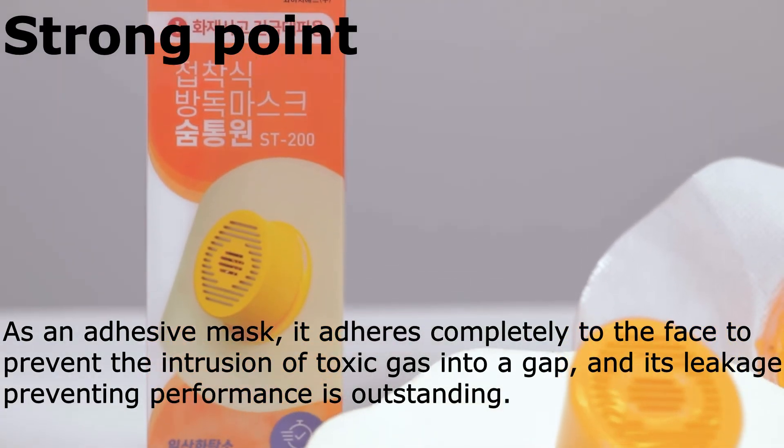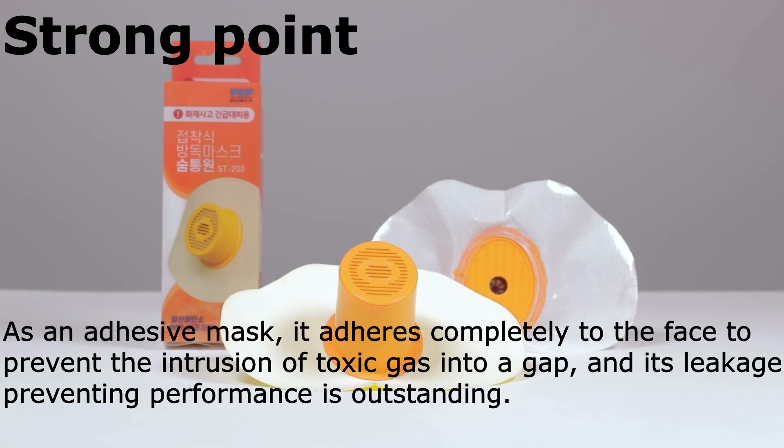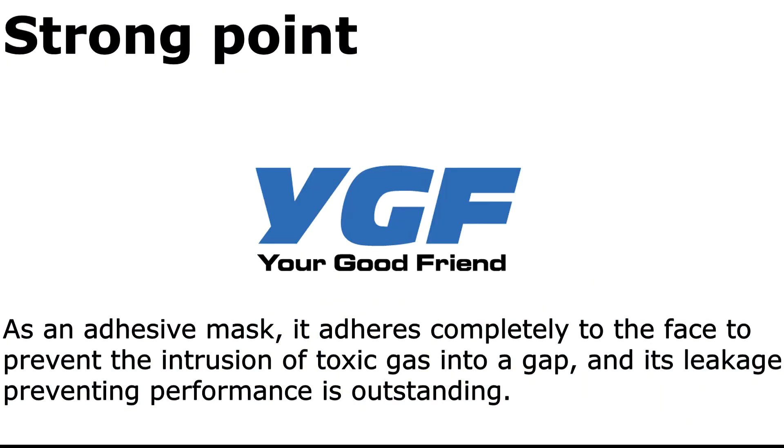As an adhesive mask, it adheres completely to the face to prevent the intrusion of toxic gas into any gap, and its leakage-preventing performance is outstanding.